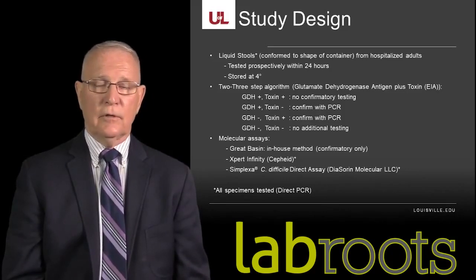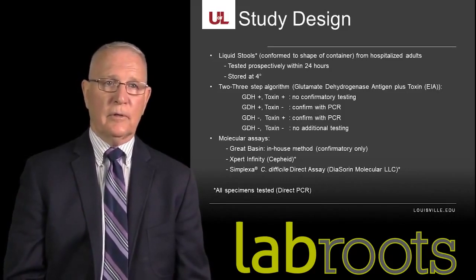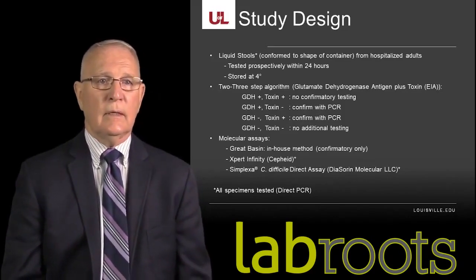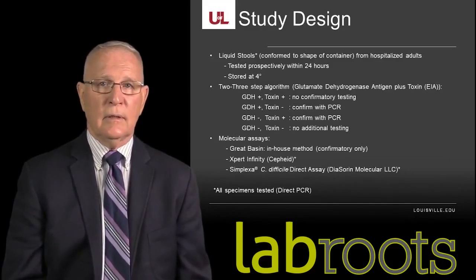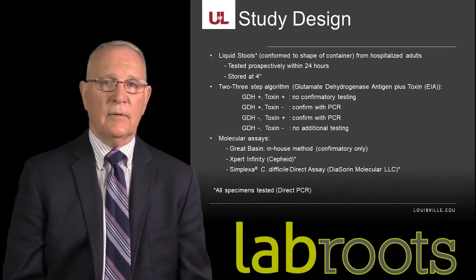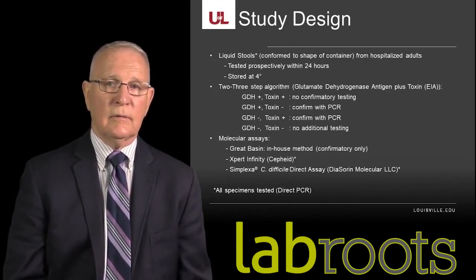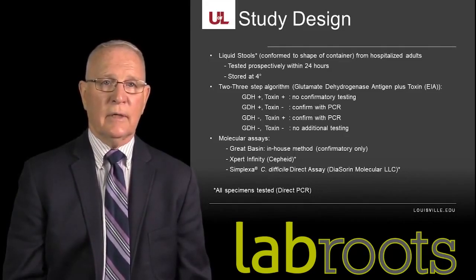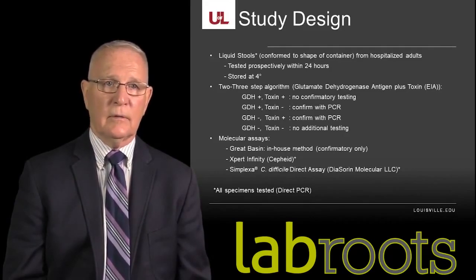We also included in the evaluation the Xpert Infinity from the Cepheid folks, and the primary focus was on the Diasorin assay, the C. difficile direct assay from Diasorin Molecular.